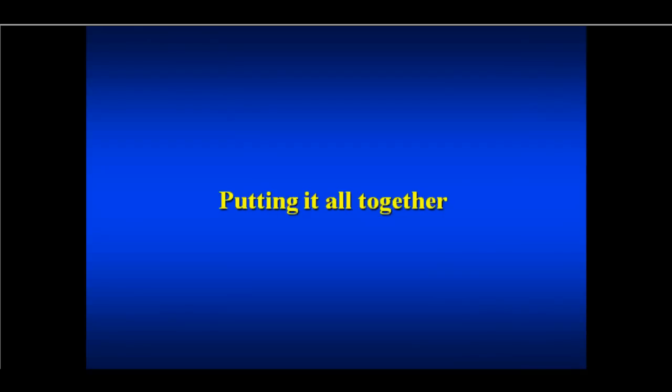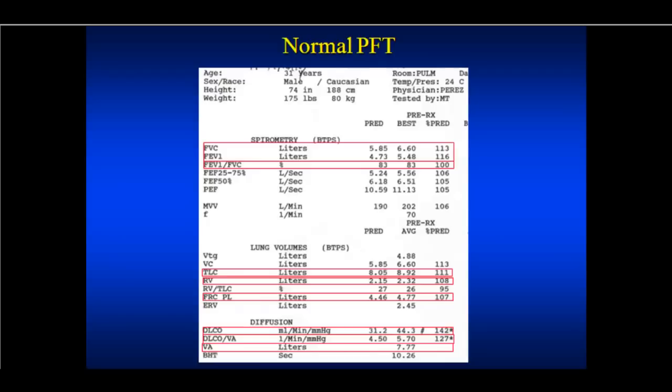This is what I call putting it all together, and then we're done. So here's our healthy individual. This one's going to be quite boring, but this is more to tell you how I look at a PFT, and no one has to do it the way I do it. It's just the way I get a certain pattern going that I think gives me the best way to look at it and the most information.